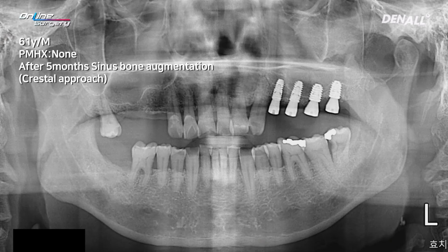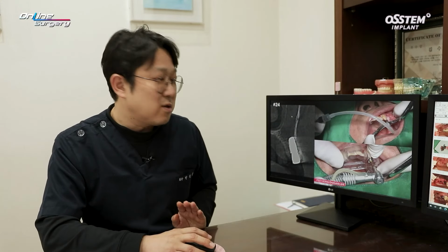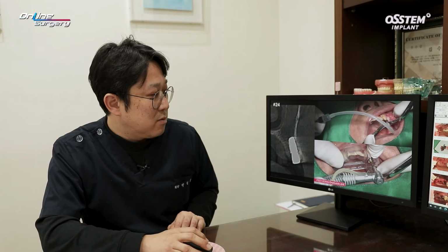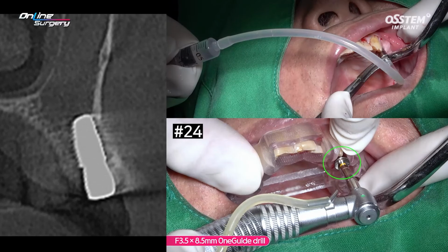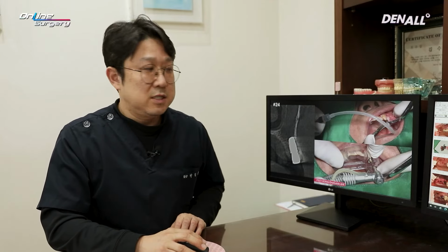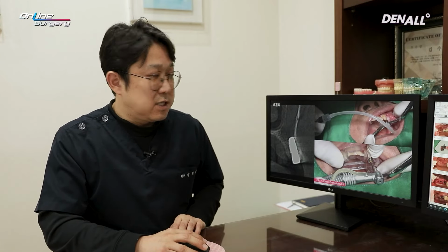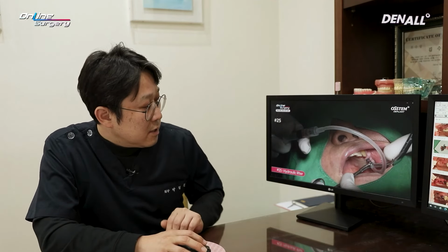This is how it looks after implant placement. Implants were placed nicely. You need to check whether implants have been placed properly within the sinus. On CT, you can see that in number 24, it looks great. In number 24, I used a one guide drill, 8.5 one guide drill, for the final time. There was no sense of sinus floor penetration then. I used one guide drill to place the originally planned 4.5 by 8.5 implant, but the sinus floor was not penetrated. That was how number 24 was placed.